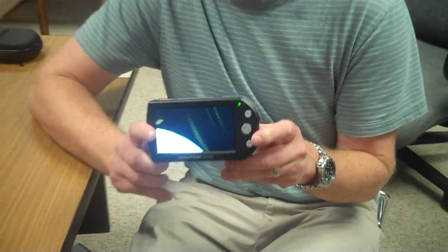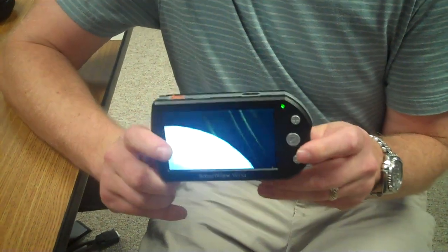Hi, I'm Brian, I'm with Lab Computers, and today I'm going to show you the new SmartView Versa. The SmartView Versa is a handheld CCTV, so it is a battery-powered video magnifier.